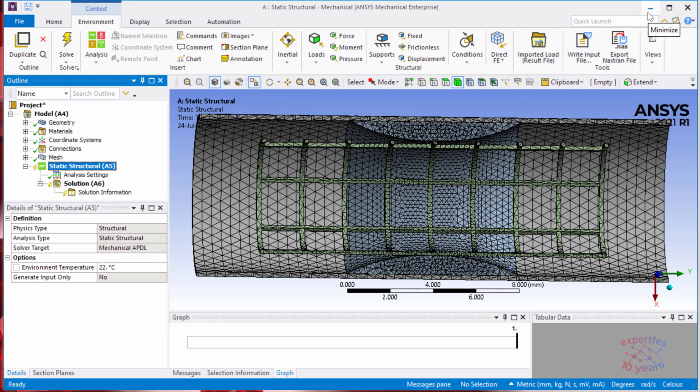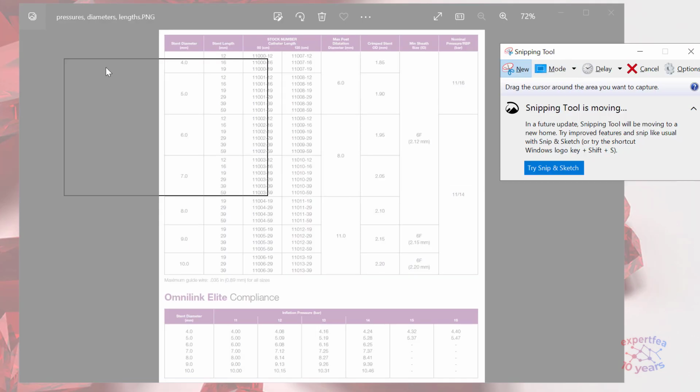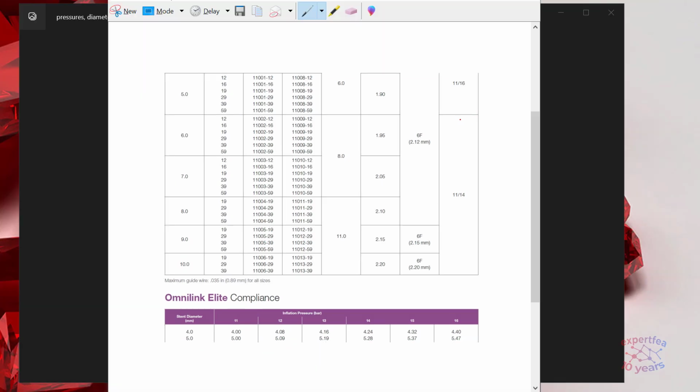I will come back a little to this image and remind you that when we have a stent diameter of, let's say, 5, the maximum post dilatation should be 6. We have here another hint: instead of 5, maybe 5.5, let's say, and we need to judge the dilatation like this. Let's make a small screenshot here, only these two, because I want to draw here.